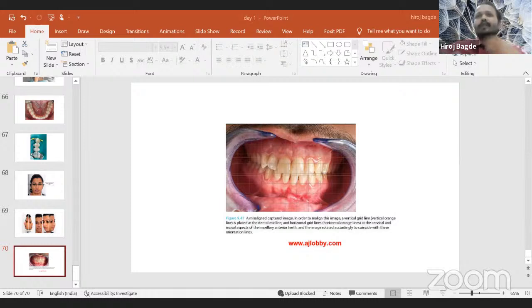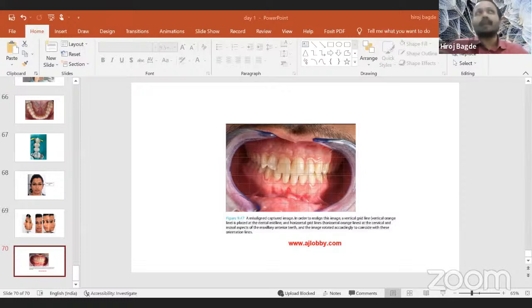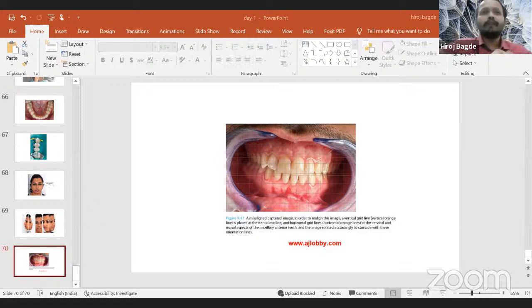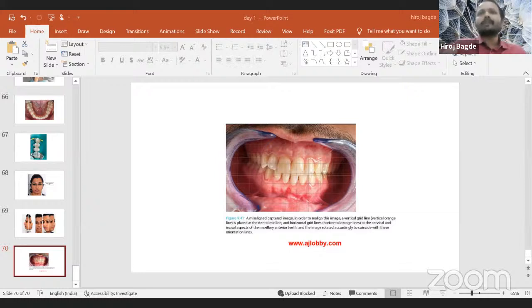The difficulty is I'm still getting cheek retractors inside. This is again something to keep in mind — when you click a photograph, your image should not have the cheek retractors, neither any type of gloves or finger pulling. Nothing should be there that will hamper the processing of the image. Now let me go to that area. There is a preview button here — once you preview, you can see it for a few seconds. You can apply it. The cropped image now looks somewhat better than the previous one.